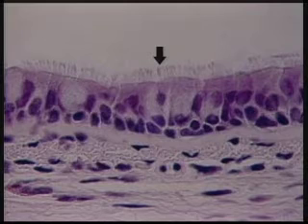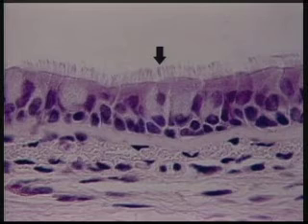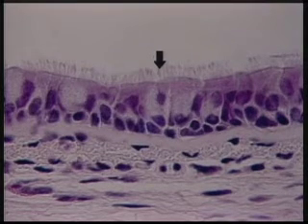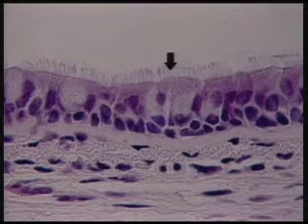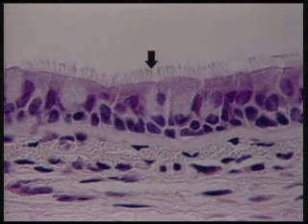This is a light microscopic image of an H&E stained preparation of a section through the bronchus of a monkey. It's shown at slightly higher magnification than the previous section, and so the cilia, which you see here, stand out a little more clearly. You can see them almost presenting an image like the individual bristles of a brush. They extend from the surface here right out into a layer of mucus, which they propel.